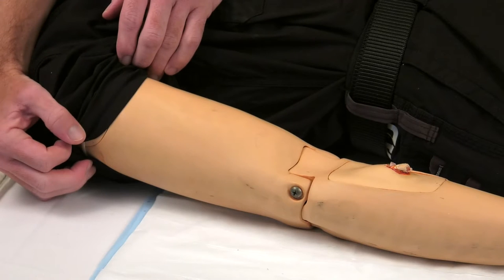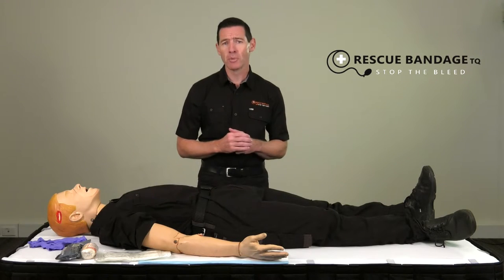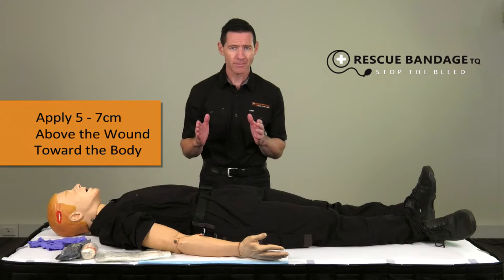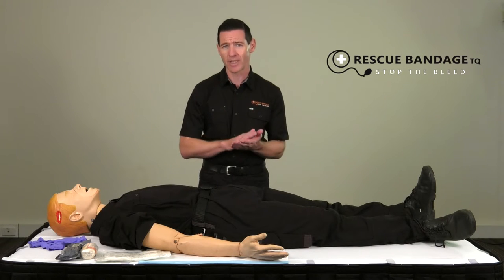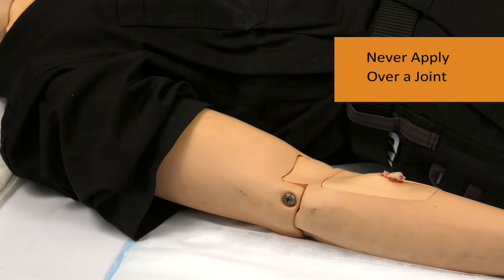Next, it's important to identify the best landmark to apply the rescue bandage. Ideally this will be about five to seven centimetres above the wound toward the body. It's ideal to expose the skin so that the bandage is in direct contact with the skin to maximise effect. And always remember to never apply the rescue bandage over a joint.